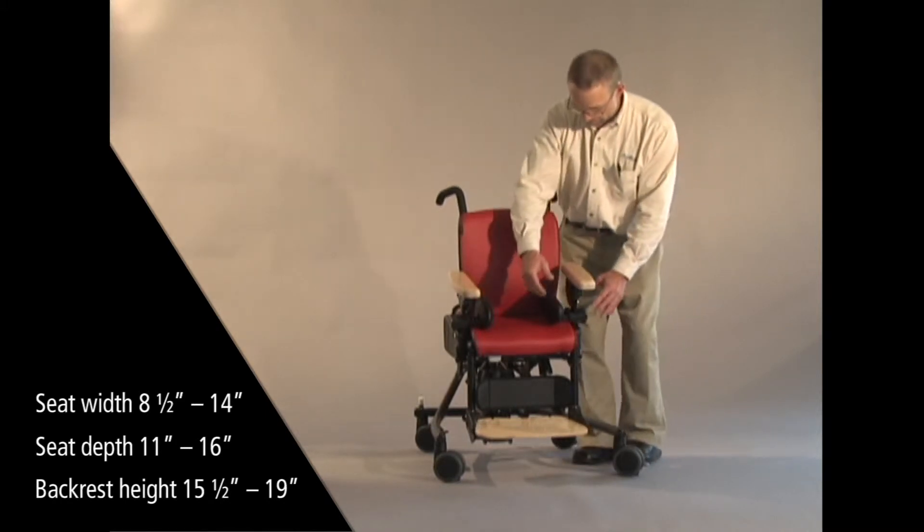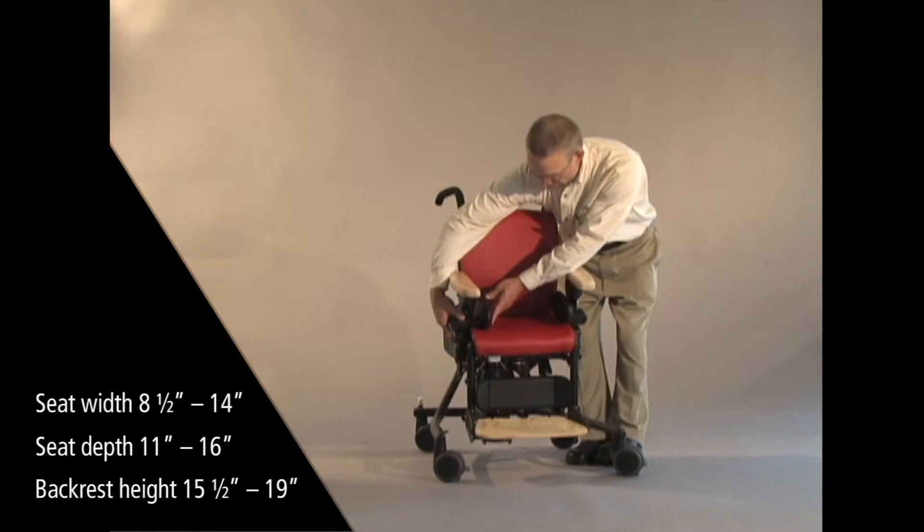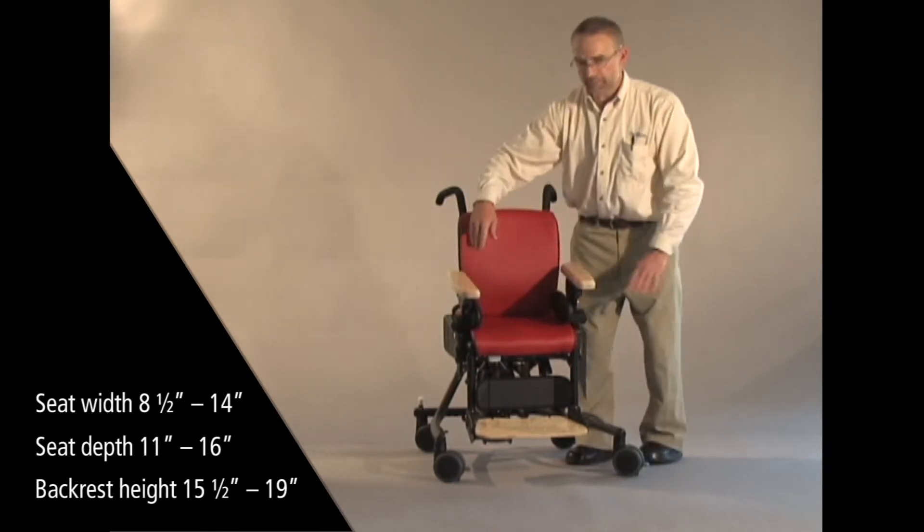If I adjust the hip guides all the way out, that width increases to 11½ inches wide.